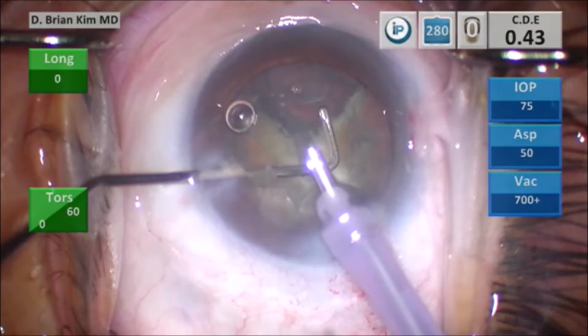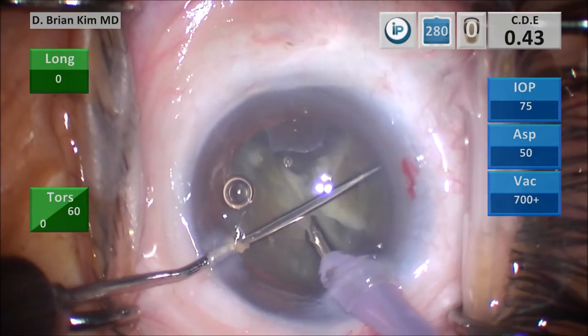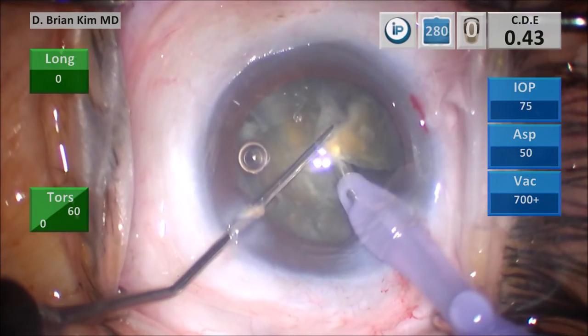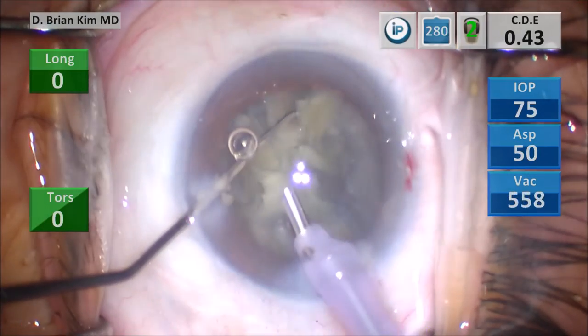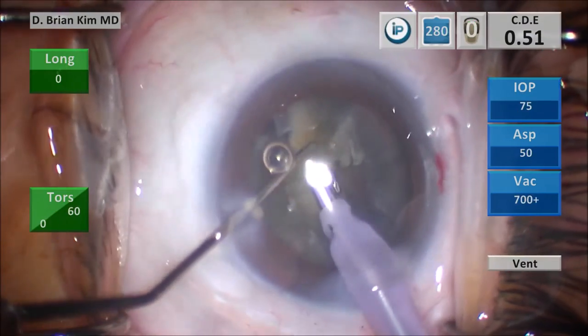Now we're going to tackle the second quadrant. You can see the chopper is flat on the surface of the endonuclear material and you can see the epinuclear ridge — that is where I'm going to go. I'm going to slide the chopper underneath the epinuclear ridge. By sliding it under the epinuclear ridge, I'm making sure I'm inside the bag. I rotate the chopper, point the tip down, pull the chopper towards the phaco tip. The phaco tip is in a deep position and it crushes the second quadrant and divides it in half.